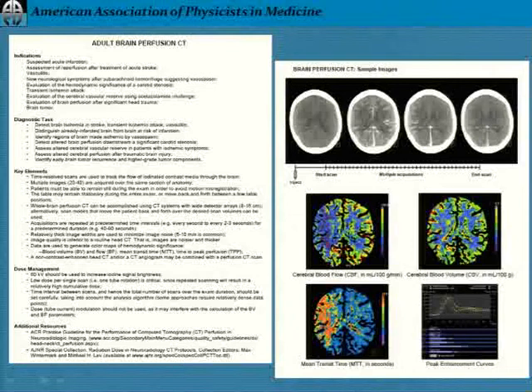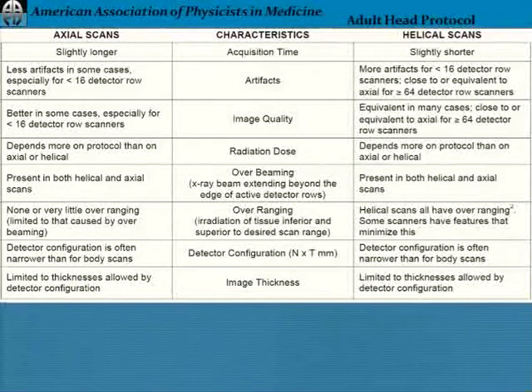We always have beginning material that it's easy to blow by, but you might want to take a look. There is a section on indications, on key elements. There might be something on dose management. They're all a little bit different because they need to be customized for the exam. The perfusion one is kind of nice because it has some pretty pictures in there too, to get everybody up to speed on what that exam is about.